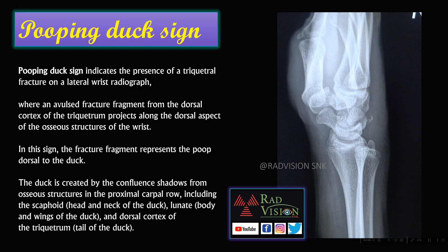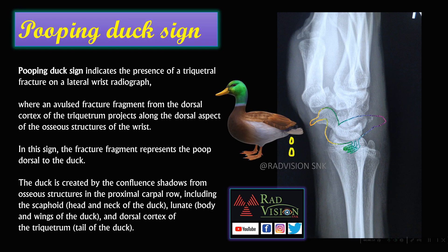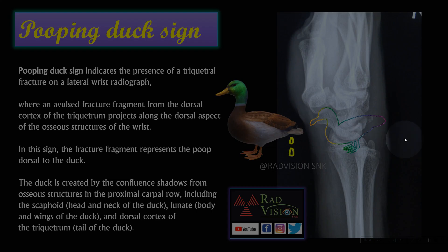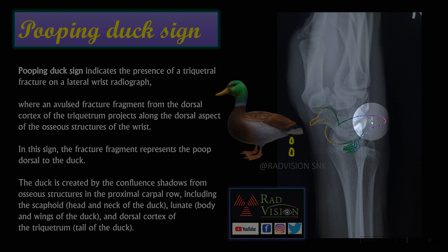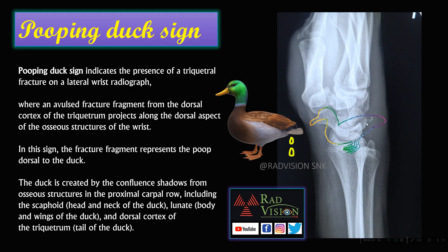This is the typical pooping duck sign — I have annotated it here. The poop is nothing but the displaced fracture fragments which are displaced dorsally from the triquetrum. Remember the pooping duck sign in triquetral fractures on lateral wrist radiograph.